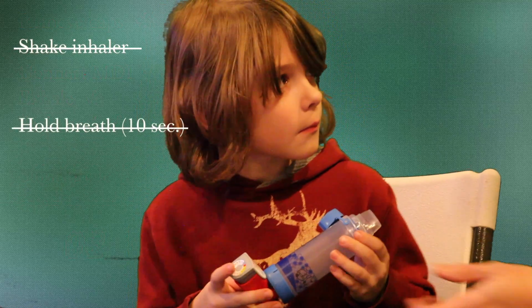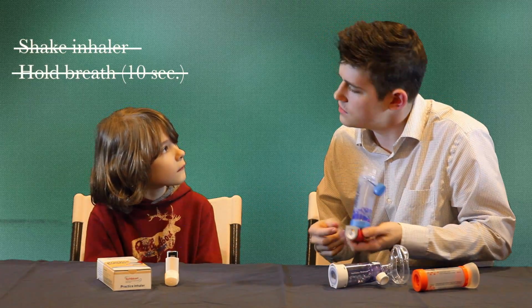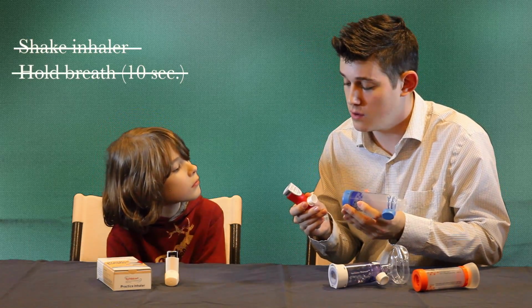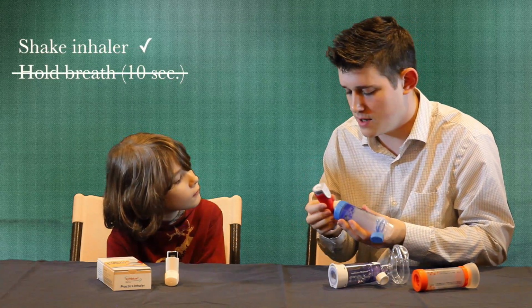That was really good, X. Awesome job. I noticed you had a little bit of trouble with a couple parts, so let's practice those again now. So the first thing, before you even connect these two, you have to shake the inhaler. And it's a little step, but it's important because you want to mix up all the medication.